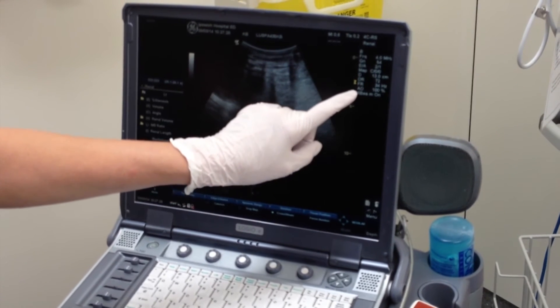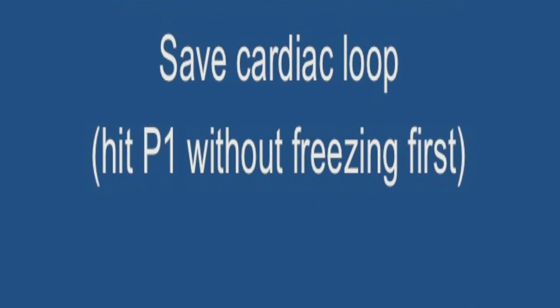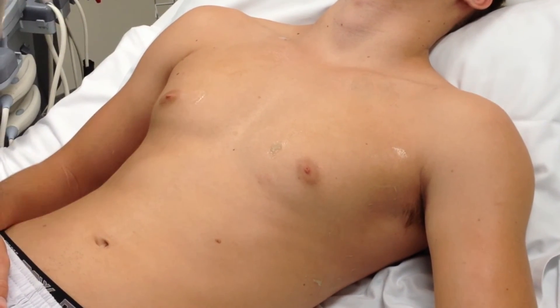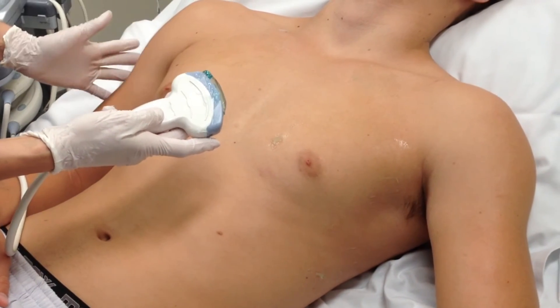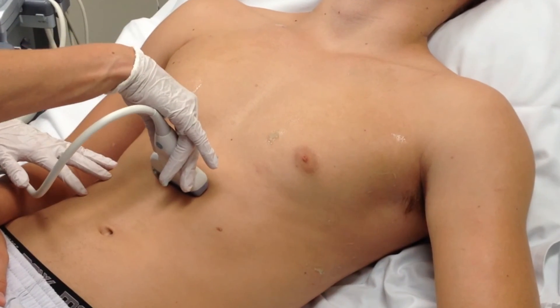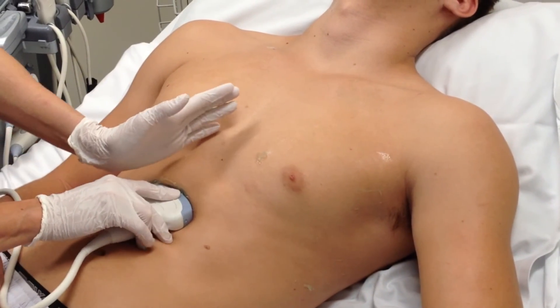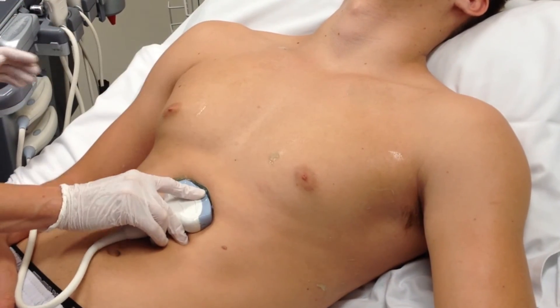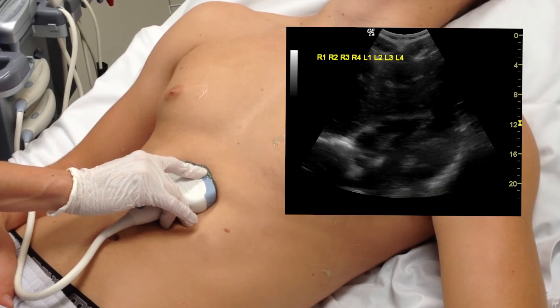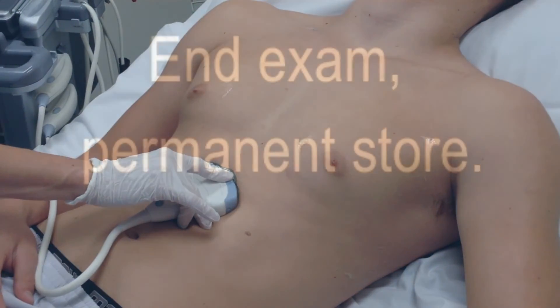Remember you want depth at least 10 to 12 cm and your focus as high as it will let you go. We are encouraging our registrars to collect a subcostal cardiac clip — it's good practice. Use a curved abdominal probe with the marker towards the patient's right, placed high in the epigastrium just below the xiphoid with your hand on top of the probe, such that when you flatten the probe to look under the costal margins there are no fingers caught underneath. You may need to point the probe towards the left shoulder or back towards the midline depending on patient habitus. It's an easy view but may often be obscured by gas in the stomach — if you can't do it, a parasternal long axis is more reliable.